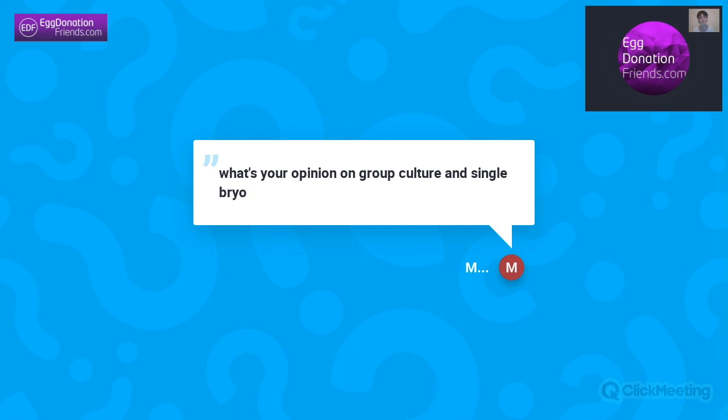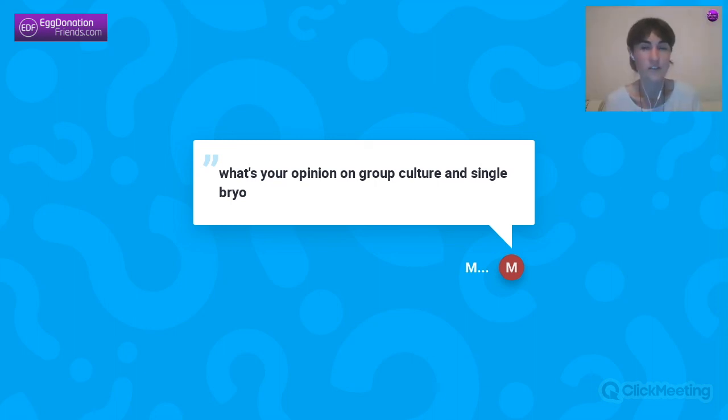What's your opinion on group culture and single embryo? I think we already came across a very similar question to this. It might be an idea, but I think it's also related to, it depends on which dish you're using and how much media is on that dish.